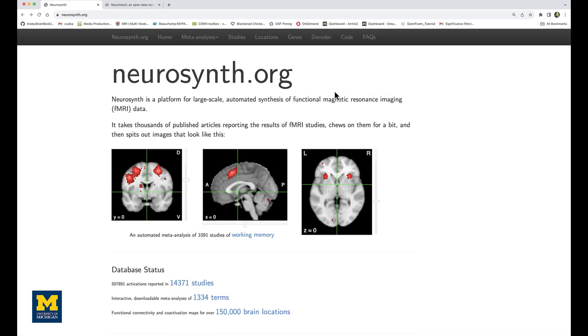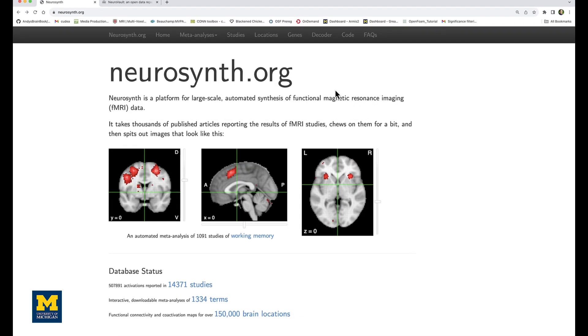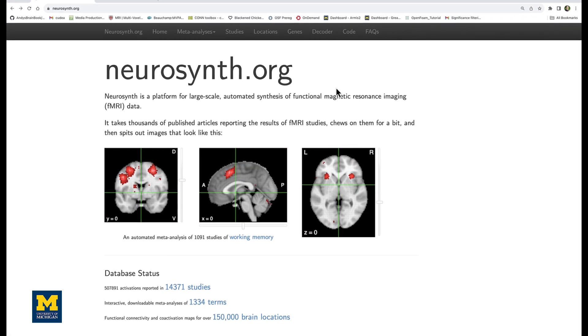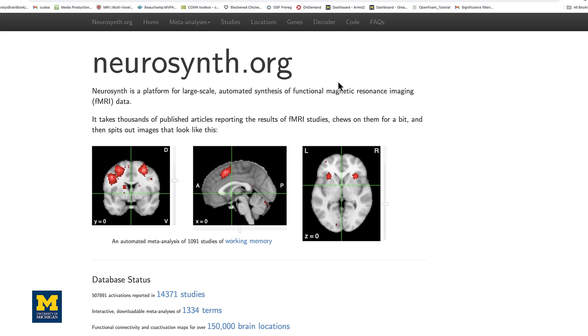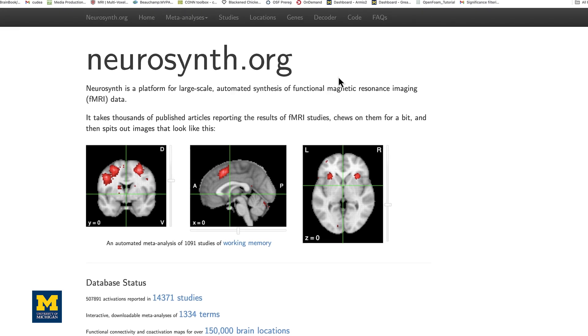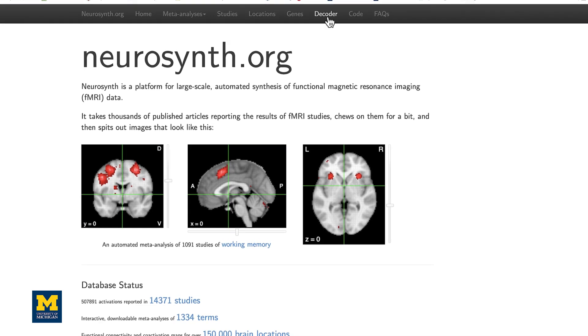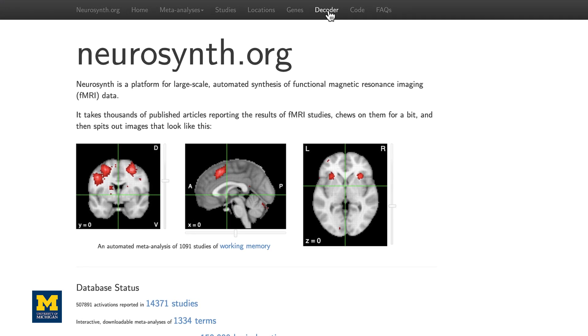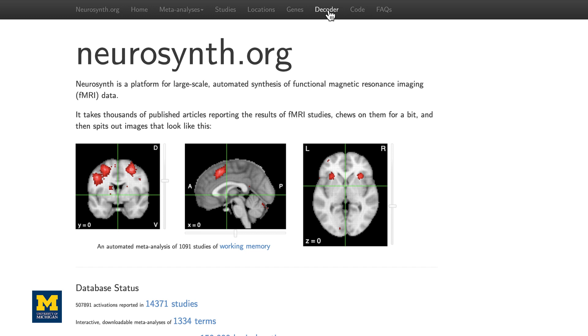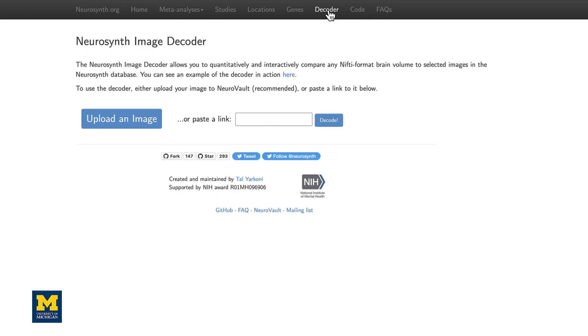For example, we can do this in Neurosynth, which we've covered in an earlier video. On the Neurosynth homepage, there's a decoder button at the very top of the screen. Click on it and you will be presented with an option to upload your own image or to click on a link to generate a meta-analysis map.